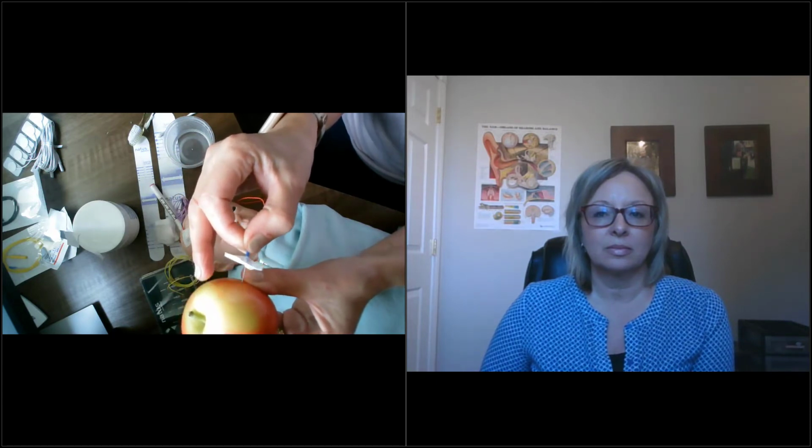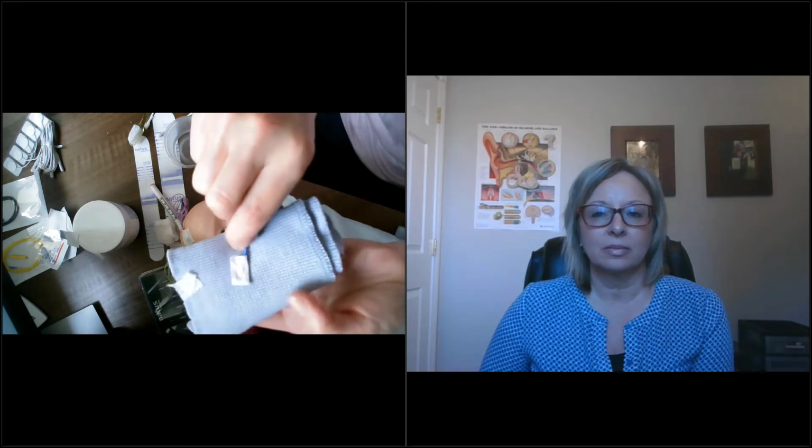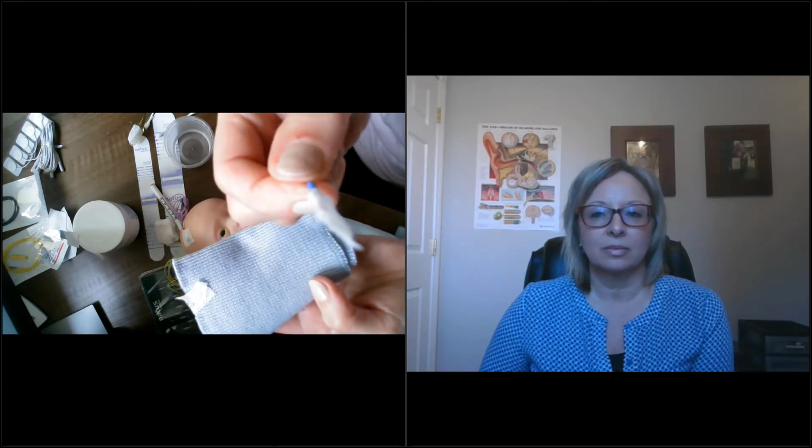I've pulled it back, so I can now, from this end, remove the needle. Imagining, we have to use a bit of imagination here, this is the baby's bed. I place it down on the baby's bed and stick the tape over it.